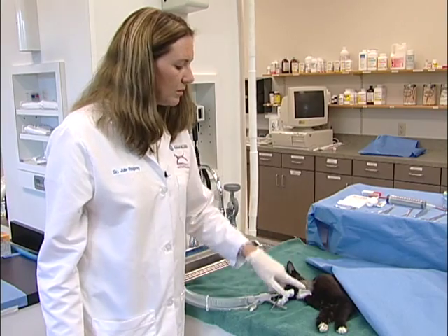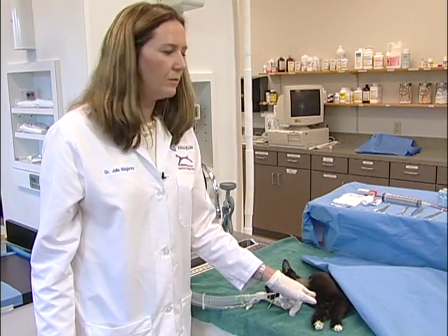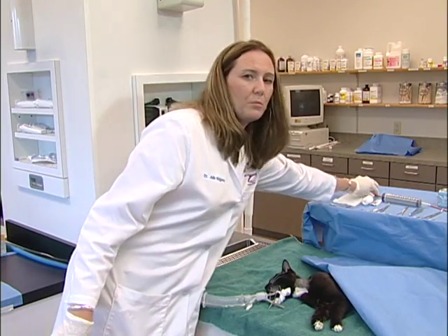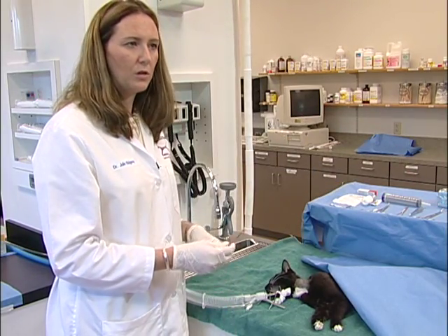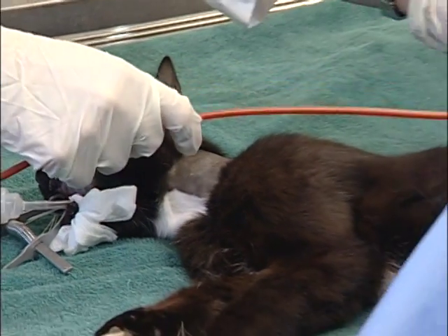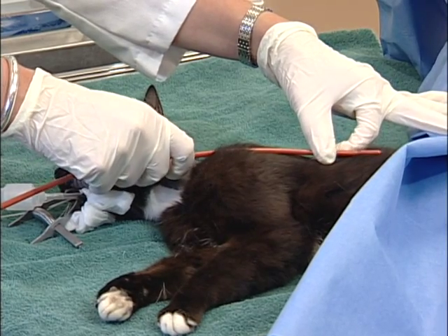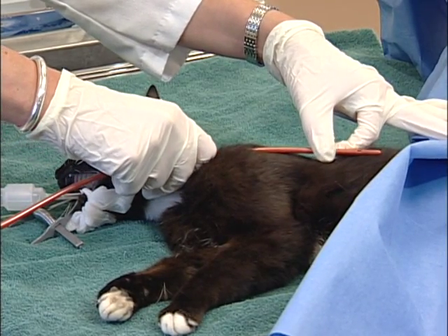It's important to note the presence of the jugular vein and its location so that this can be avoided. It is also important to pre-measure your tube and make sure that the length is appropriate. The tube should extend to about the ninth rib — you want the tube to be in the distal esophagus. You do not want it to extend into the stomach.